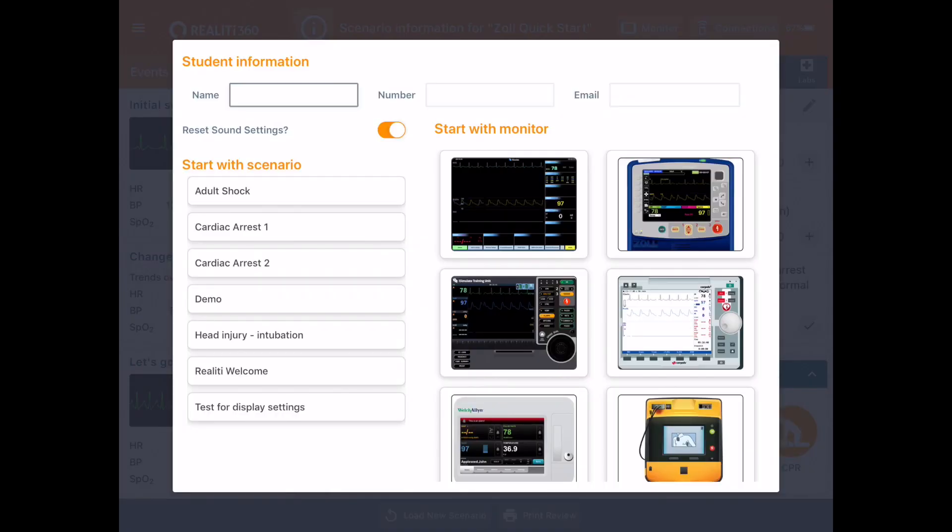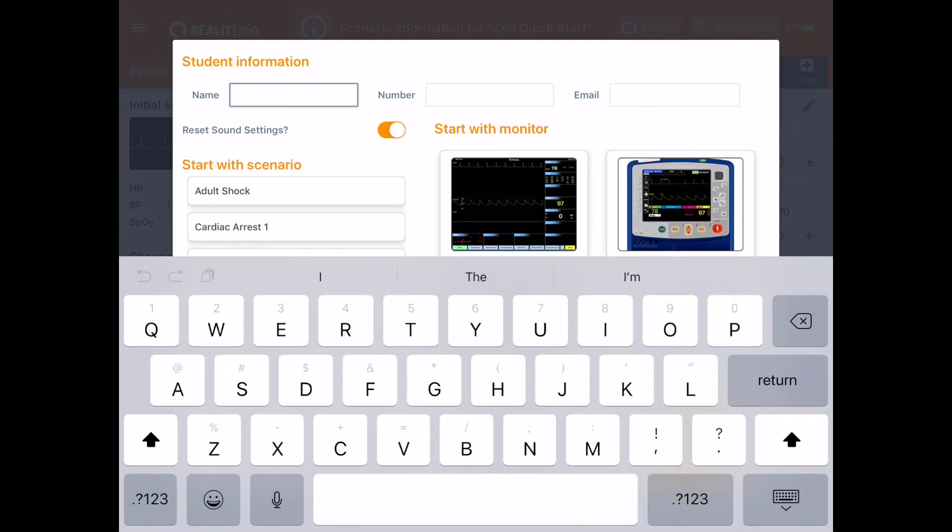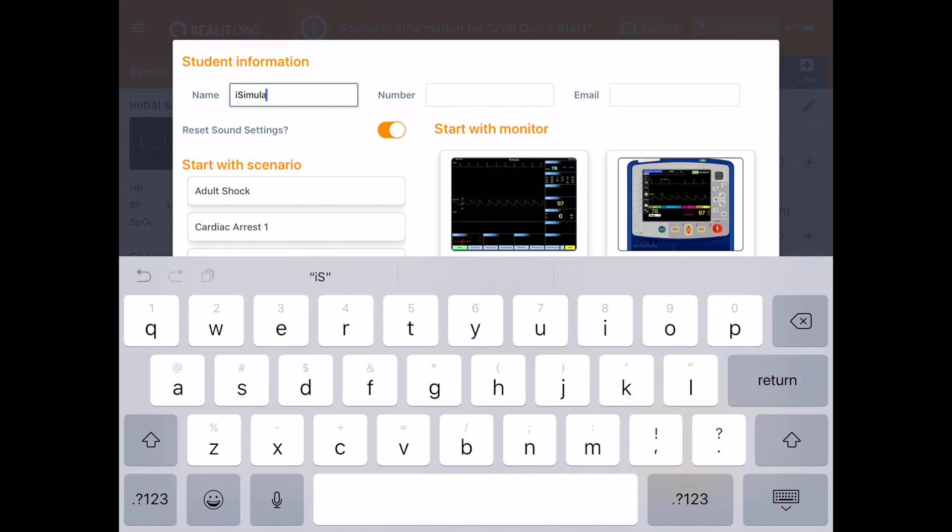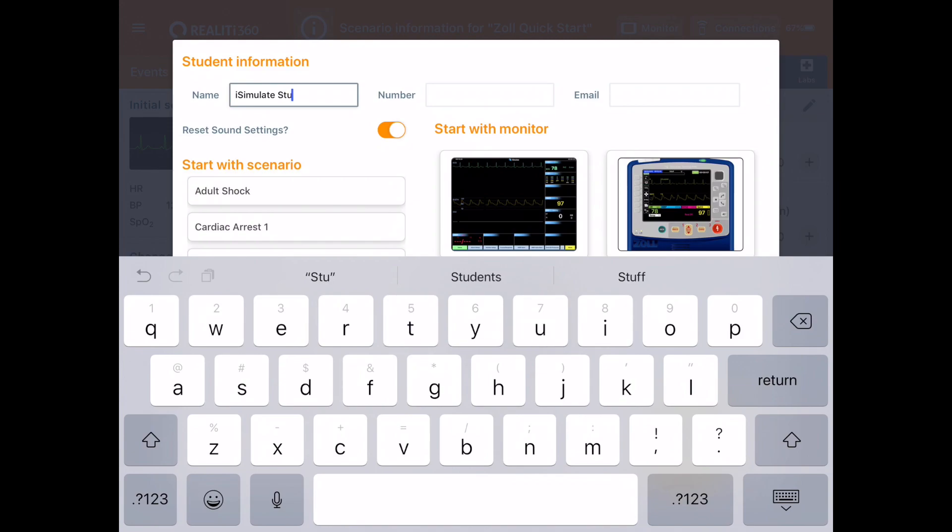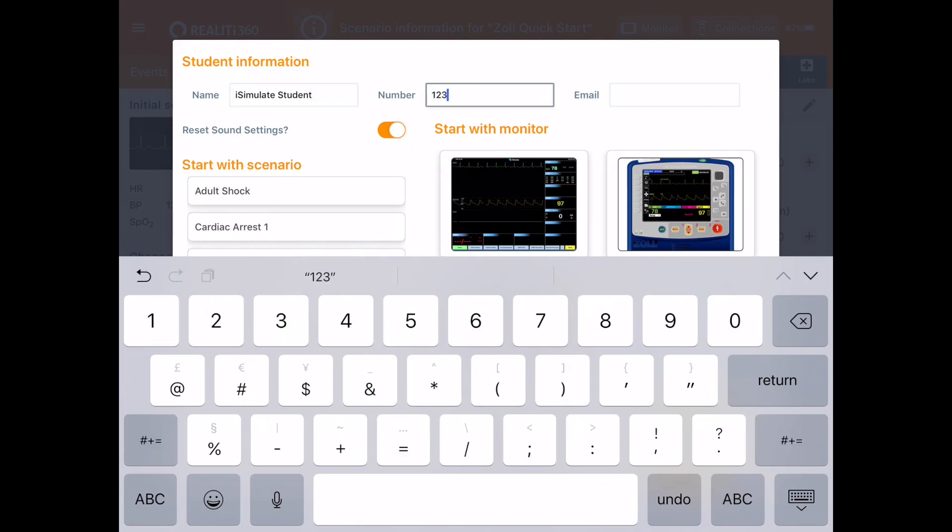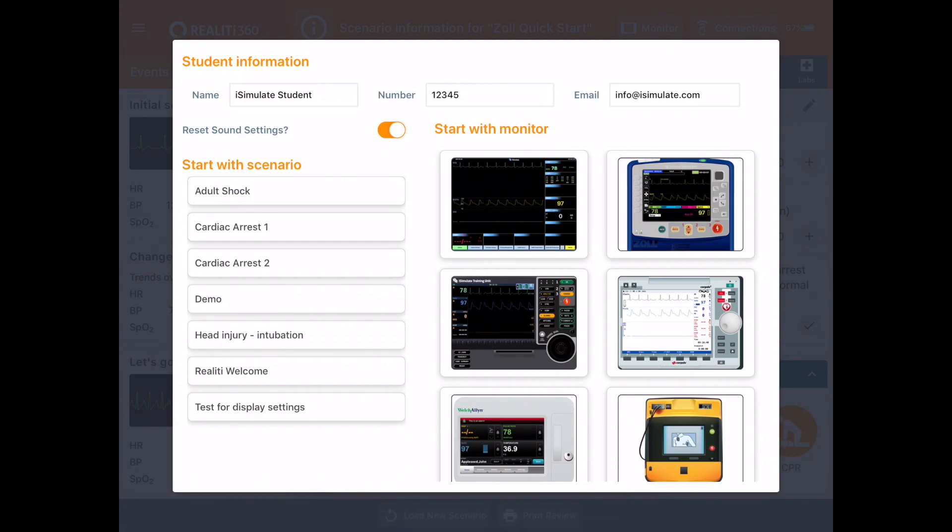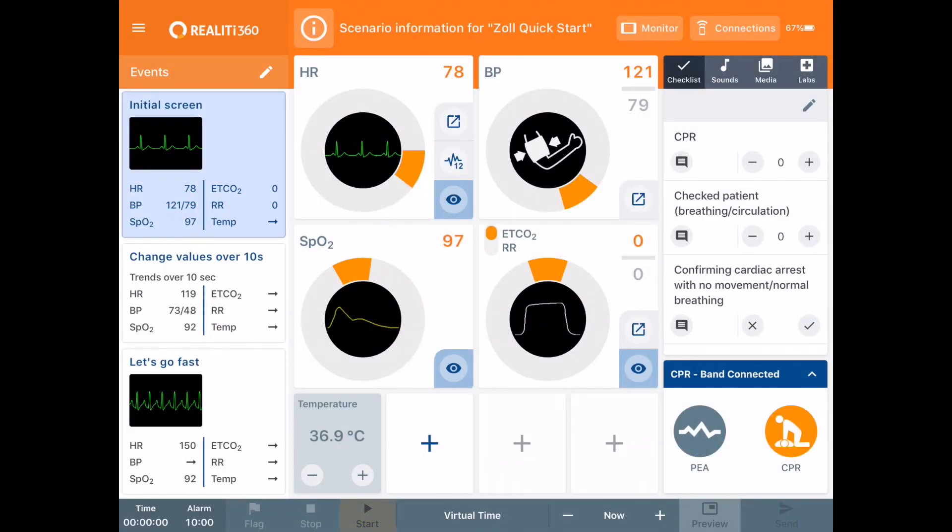So if you start off with control and tap to connect to a monitor, when you connect to that monitor you're presented with a screen which asks you to enter some student information. So I'm going to insert it here iSimulate Student. The number is 12345 and the email address is info at iSimulate.com. And then I can start with a scenario, let's say for example the ZOL X-Series here. And then I can press start.